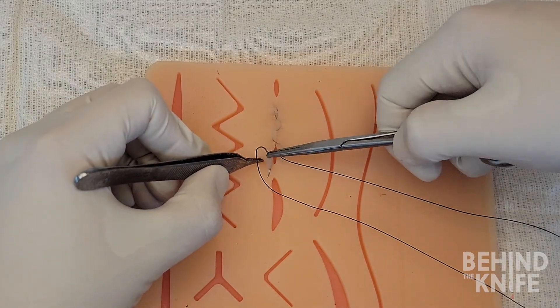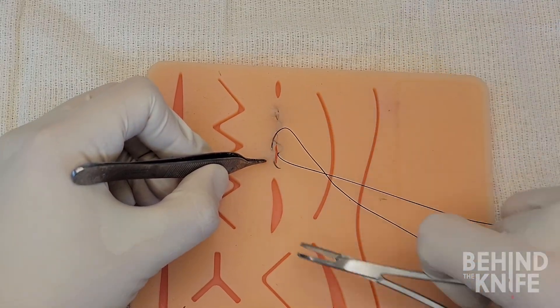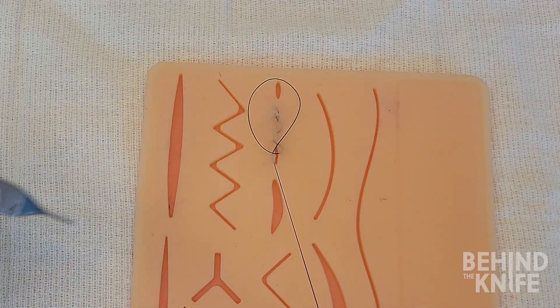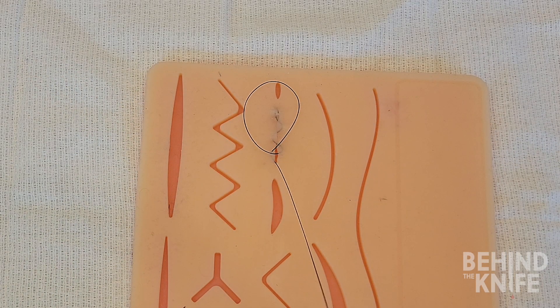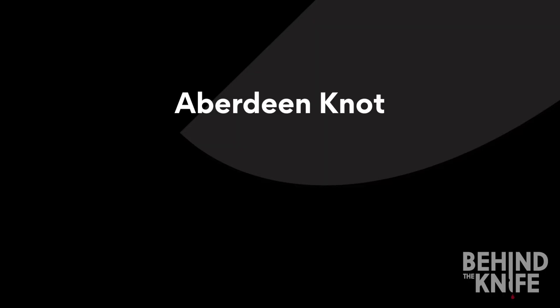As we make our throw for the final bite, we will leave a loop of suture to tie our stitch. Now you can instrument tie at this point as we've done in the simple running suture video, but for this video I will be demonstrating an Aberdeen knot.